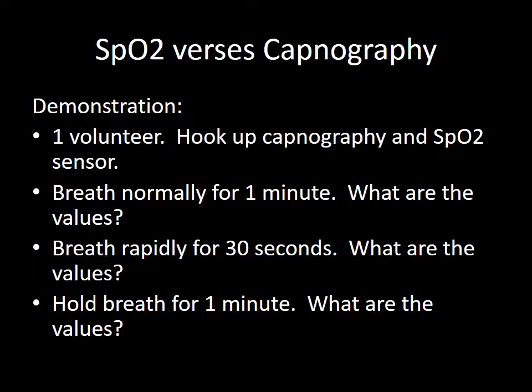You can't change your SpO2. It might fluctuate one or two, up or down a percentage, but you're not going to significantly change it. You're going to go unconscious before your SpO2 changes. You can't consciously, under normal conditions, change your SpO2. But if you hold your breath for a minute, the capnography is going to alarm at 30 seconds. You're going to see capnography go quickly down to 0, and your respiratory rate quickly to 0.